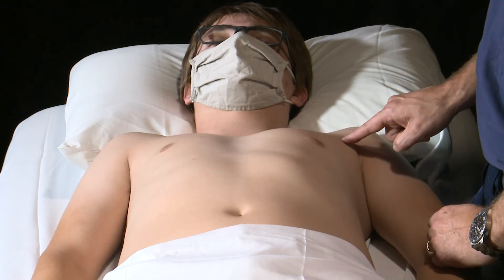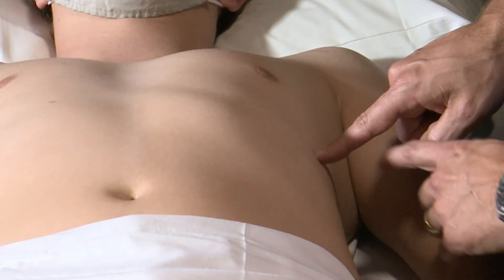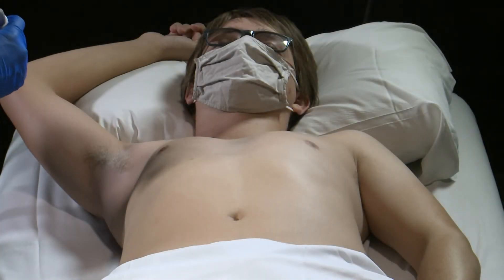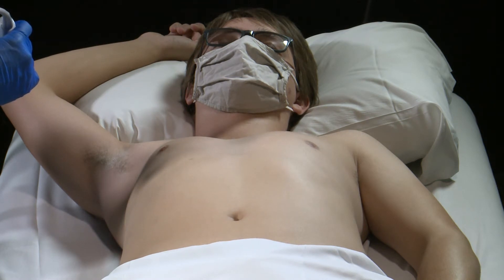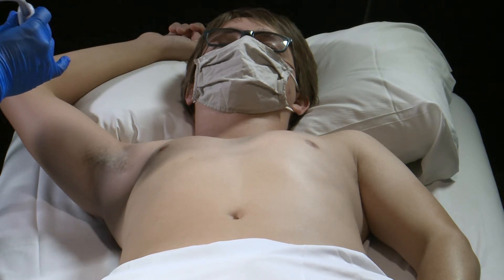Again, we are going to draw an imaginary line along the anterior axillary line and then just above the nipple to create those four zones. When scanning using the 8-zone method for lung ultrasound, we are going to divide the chest into 8 zones — 4 zones on each side of the chest.